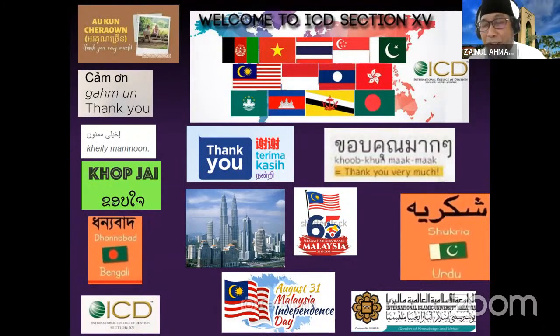However, titanium is not that cheap. You have to buy the titanium. But nowadays we have EBM, which we now have in Malaysia. Electron beam melting, EBM, is basically for titanium. If you have medical grade, powder-based titanium, because it is medical grade and produced in a sterile 3D printer, you can bring that directly to the patient, like a cranial implant or mandibular implant. That can be done directly as long as you have that 3D printing machine. But that one is quite expensive, I think.